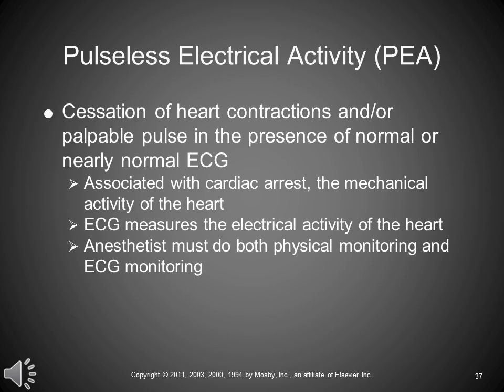You must do both physical monitoring and ECG monitoring. Just because that ECG is going doesn't mean the heart is. Feel a pulse, hear a heartbeat, make sure the heart is good. The patient and the machines must match up. The patient and the machine must make sense in light of each other.